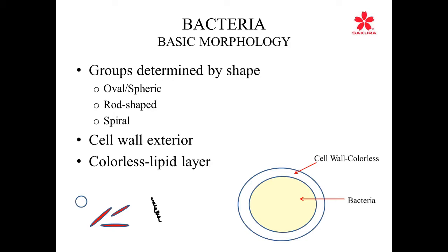The organism is generally so small that this lipid layer would be stripped out during the procedure, so you would use some other method of staining, like silver impregnation. And the last is fluorescent staining, where we use a fluorescent dye to mark the bacteria, and then under a fluorescent scope you can see it fluoresce against a dark background.